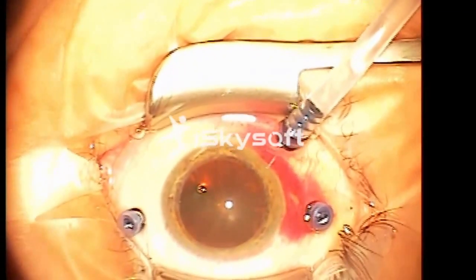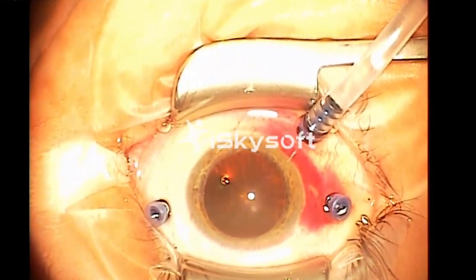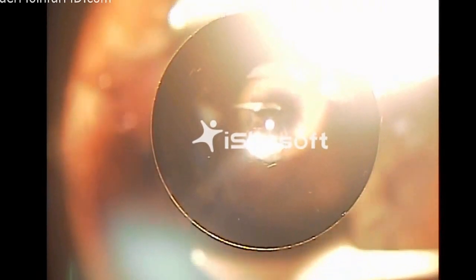And that last cannula was the third and final cannula through which the instruments are inserted and removed into the eye. Now in a few moments you'll see a round looking lens. That's the lens that's going to be put into place. This is a non-contact wide field lens. One of the challenges that retina specialists have is trying to ensure the best view possible, both for the safety of the patient and for the ease of the surgery.